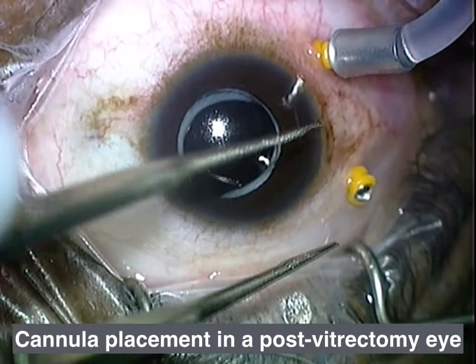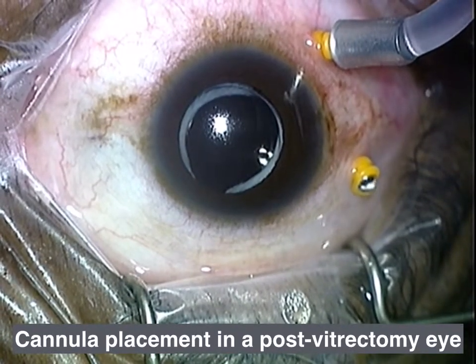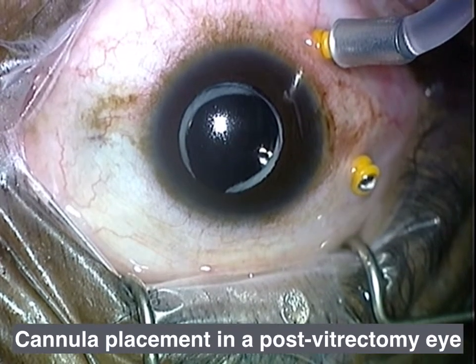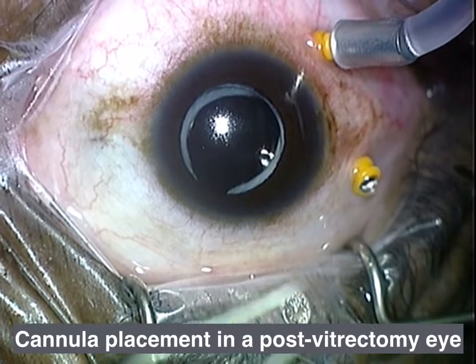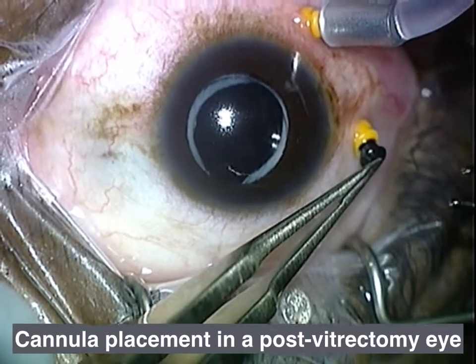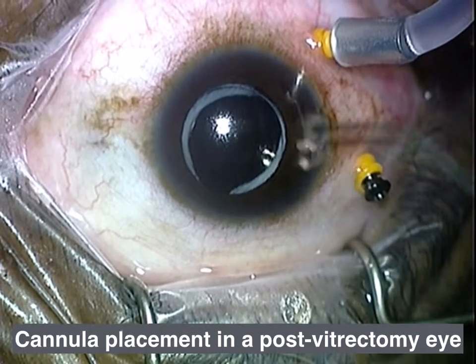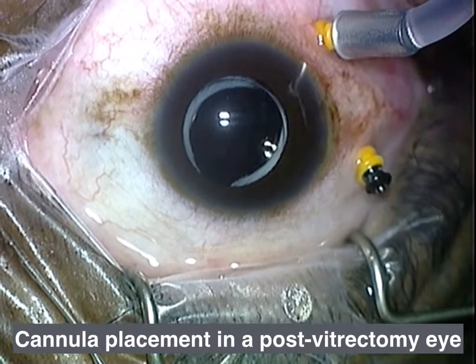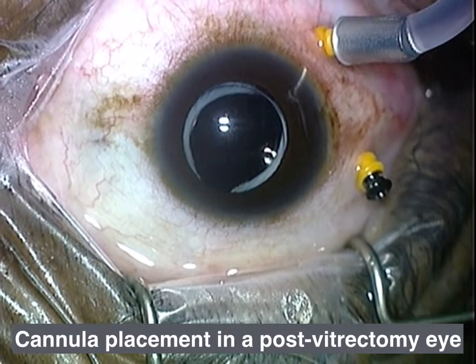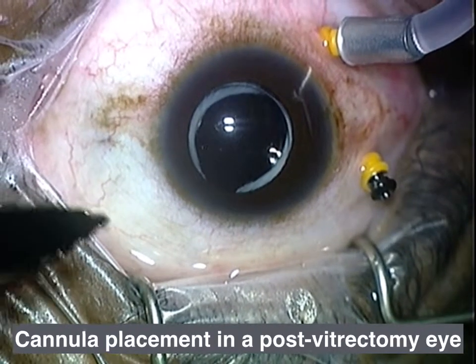If you don't squeeze the infusion line with the flat part of your 0.12s — and you don't want to use the sharp tips — then the pressure placed on the eye when you're placing that sclerotomy is going to cause the fluid that's in the eye to be expressed retrograde into the infusion cannula. You can see all the fluid freely flowing from the eye at this point. I put a plug in here — again, this is the pre-valve days.